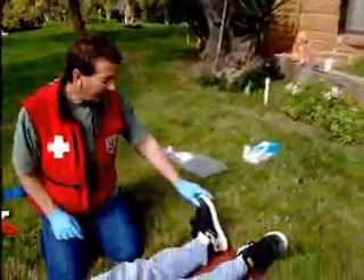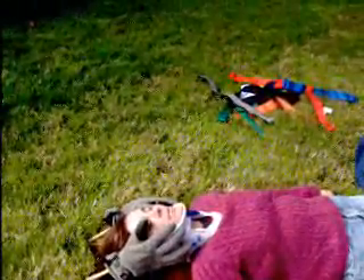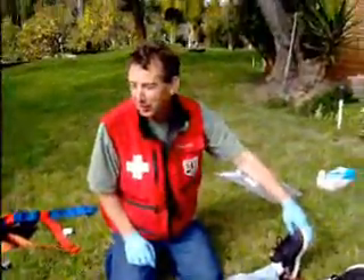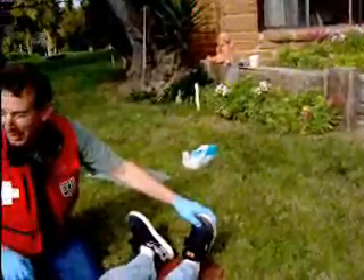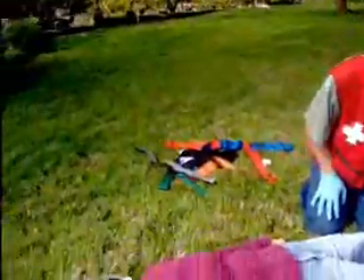It's a splinting device — what do we always do before we splint? We always have to check CMS. Before you put the patient on the backboard, you need to check their CMS. Can you wiggle your toes for me? Do you feel any tingling? No. What toe am I touching? The pinky. How about the other foot? That's my big toe. Can you wiggle them? Any tingling? No. So I've checked CMS.